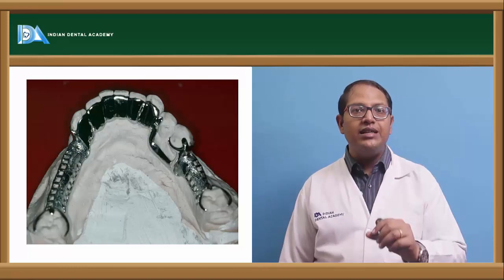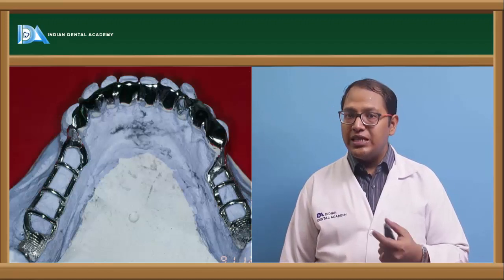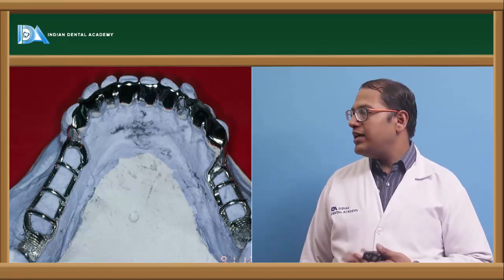Now if you have to place teeth, we have only less area present. Whereas in the lattice type, you can place the teeth in between as well, keeping in mind after the denture base is formed over this. So of course that is the trial part. So this is one advantage with these.